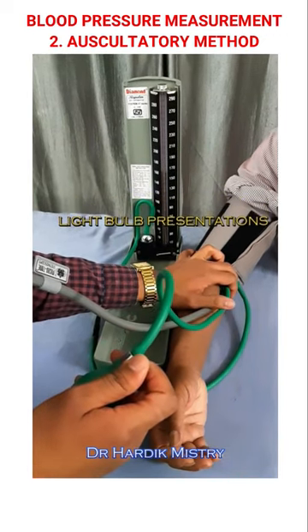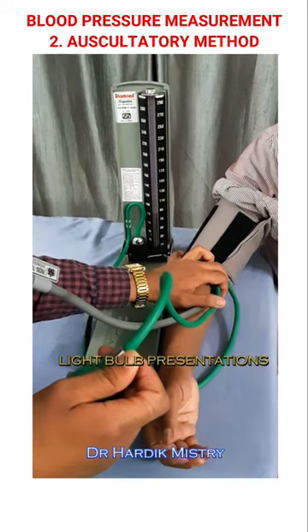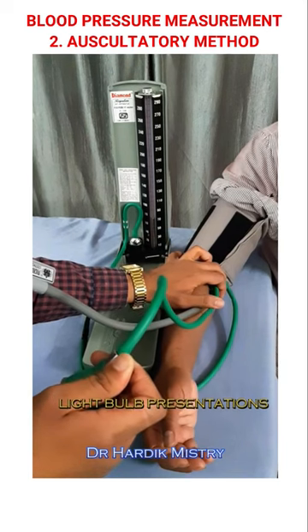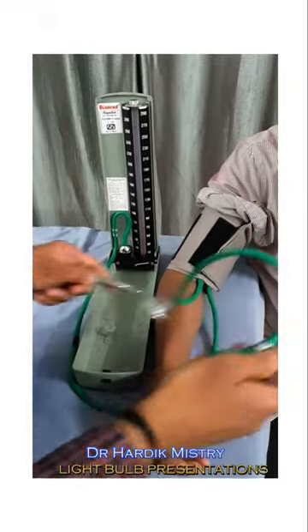Slowly open the leak valve screw and reduce the pressure. Mark the pressure when you hear a sound — it's the systolic blood pressure. Continue lowering the pressure. Mark the pressure when the sound disappears — it's the diastolic blood pressure. So this auscultatory method measures both systolic blood pressure and diastolic blood pressure.